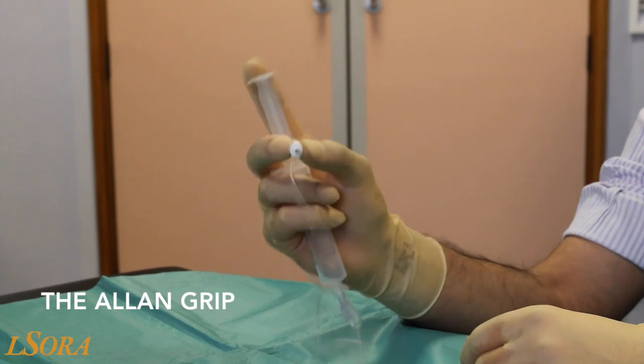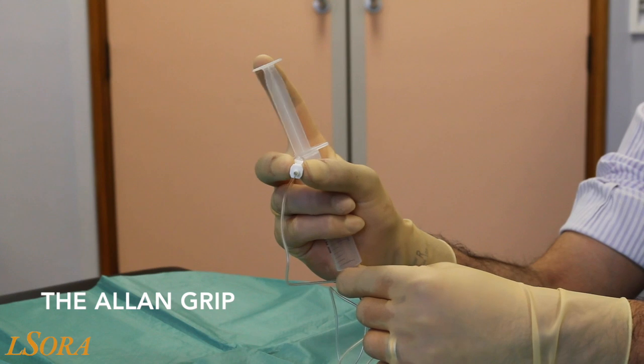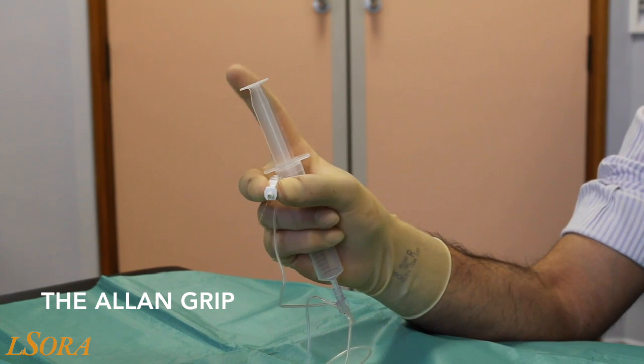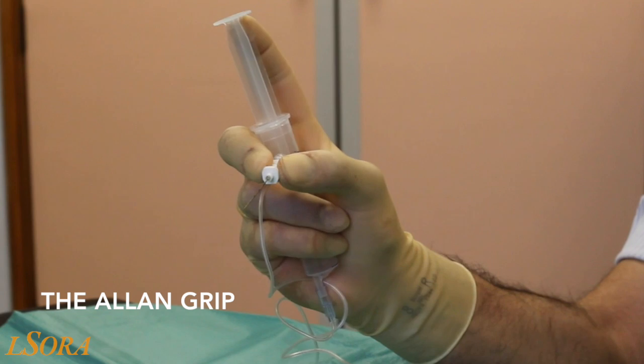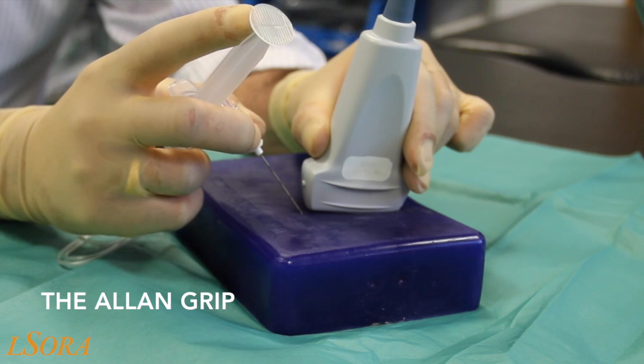The syringe is placed bevel-facing downwards into the palm of the hand and gripped by the little and ring fingers, whilst the index finger is used to aspirate and inject on the plunger. We will now demonstrate the Allen grip on a phantom.